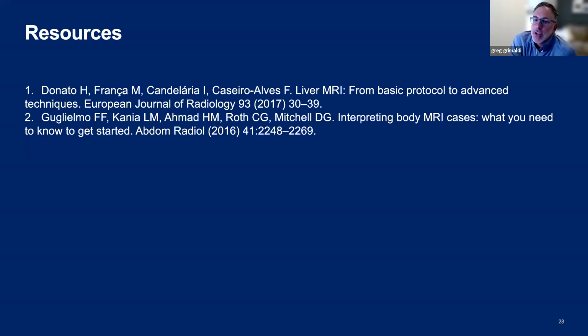Yeah, when you have an indeterminate hepatic lesion at CT, it's probably best to go to MRI because of the soft tissue characterization. The ability to characterize the soft tissue is far superior to CT. I think you'll get much more information out of the MRI. So usually that's the algorithm, is to go to MRI. Perfect. Thank you so much. You're welcome.